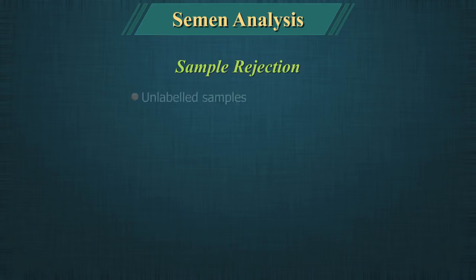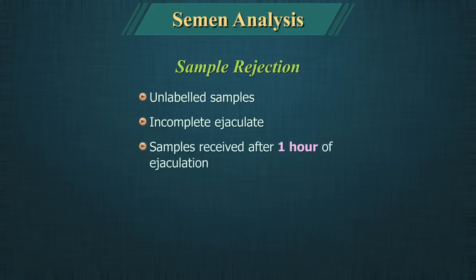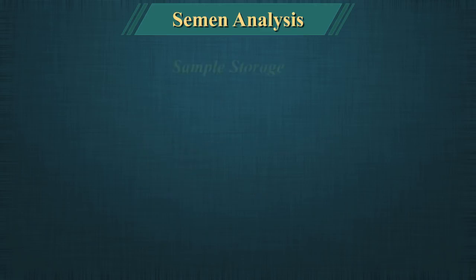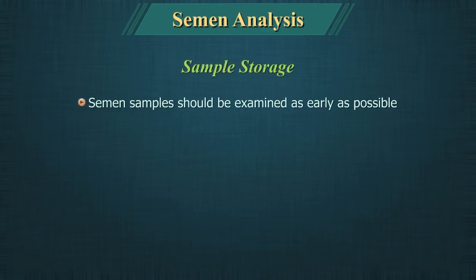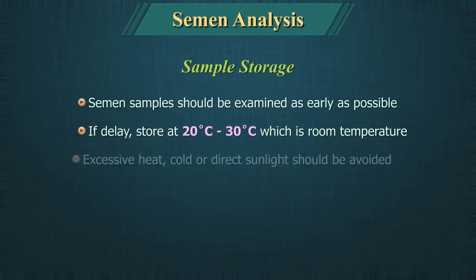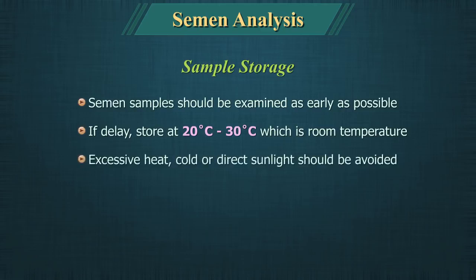Sample Rejection: Unlabeled samples, incomplete ejaculates, and samples received after 1 hour of ejaculation or inadequately transported samples should be rejected. Sample Storage: The semen sample should be examined as early as possible. If delay is likely, store at 20°C to 30°C (room temperature). Excessive heat, cold or direct sunlight should be avoided. Do not store the sample in a refrigerator.